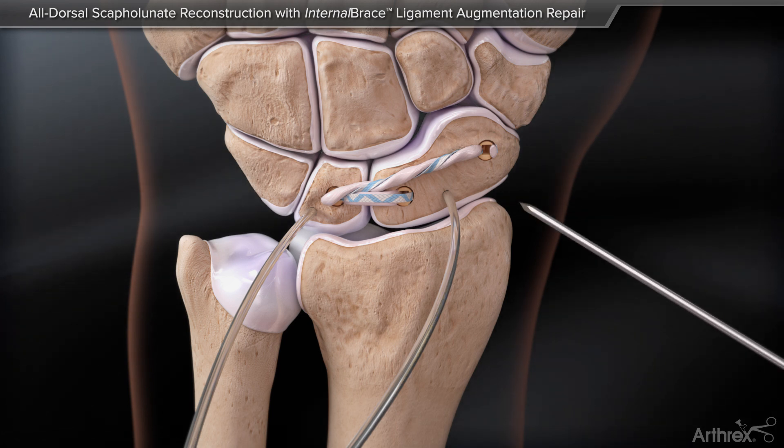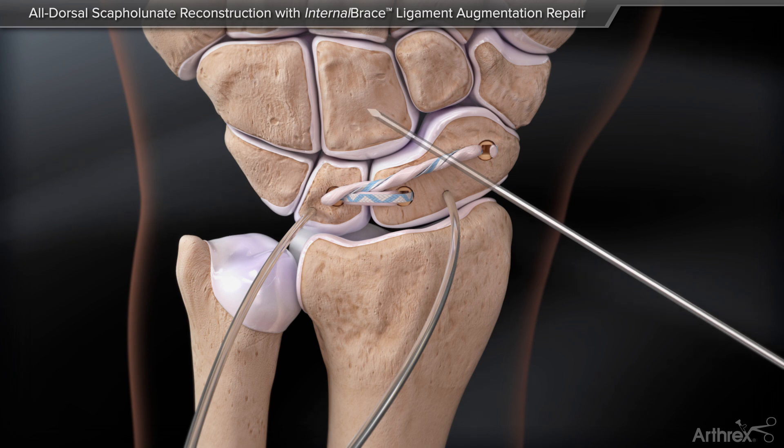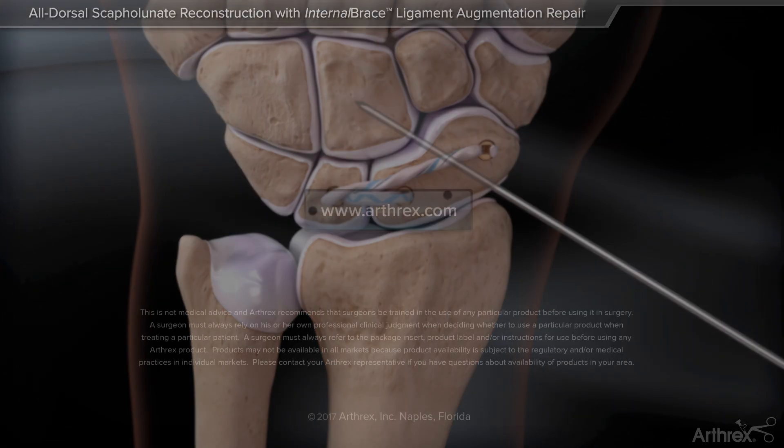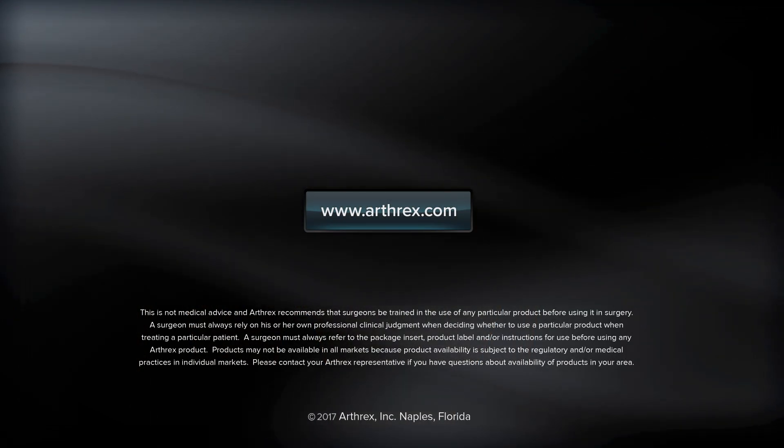An anti-rotational guide wire is placed from scaphoid to capitate and capped in for six to eight weeks, with the scaphoid immobilized in a cast.